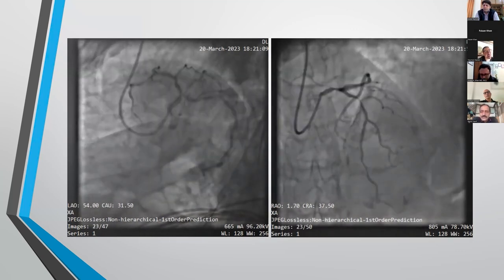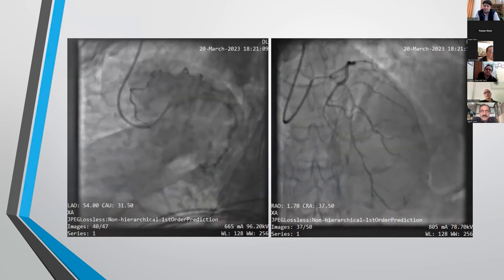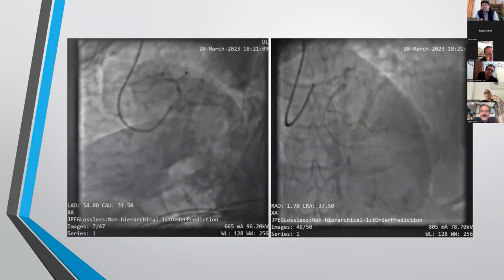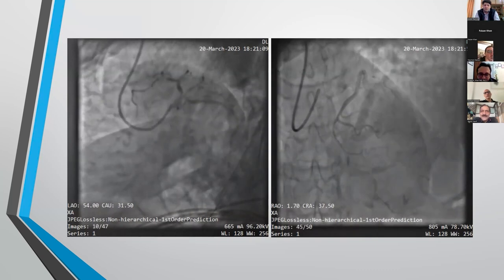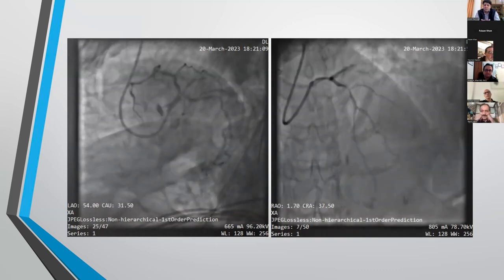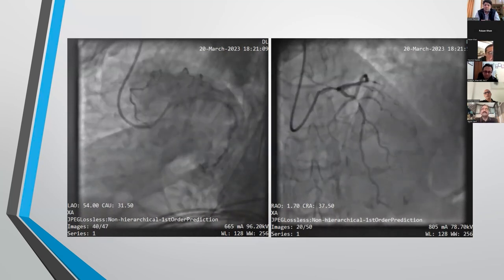So I think then you have to put in the clinical picture and everything together to decide which is the right answer, because then you want to go for intravenous infusion to really get the right FFR if it comes out negative. There was no discrepancy in this case; I think he must have put it with some other vessel. But in some cases, where there was a discrepancy between the FFR and IFR, you can rarely see it.